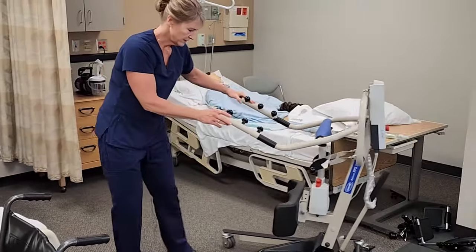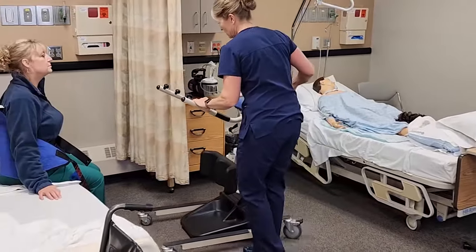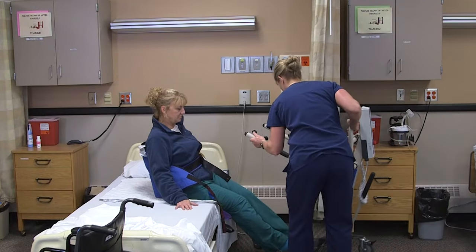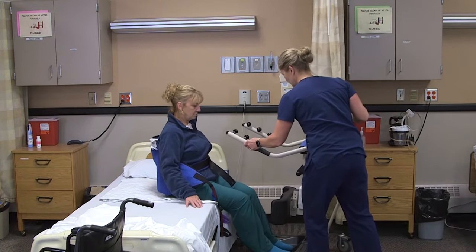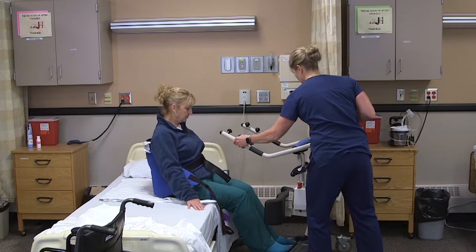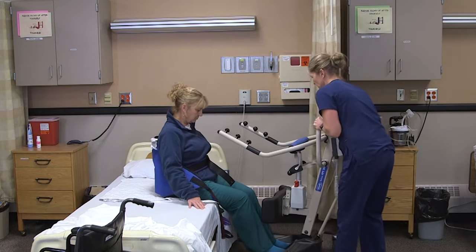Then we'll get the lift in. I'm going to have you pick your feet up. We're going to be really careful as we move this in so we don't hit her with the lift. Sometimes you need to open the legs on the lift to get it around the bed.